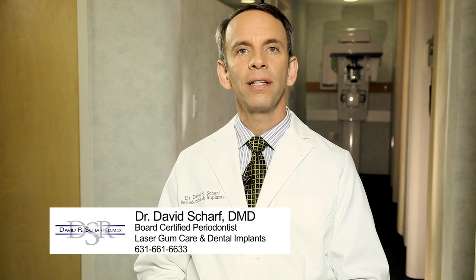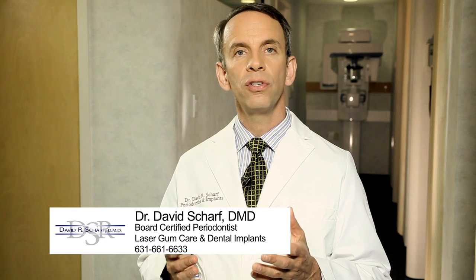One exciting piece of technology we have in the office is called PreViser dental software. And PreViser is risk analysis software. Basically what we do is after we examine a patient, we put that clinical data into the software program, and then we take measurements from the patient's x-rays and we put that information into the software program as well.